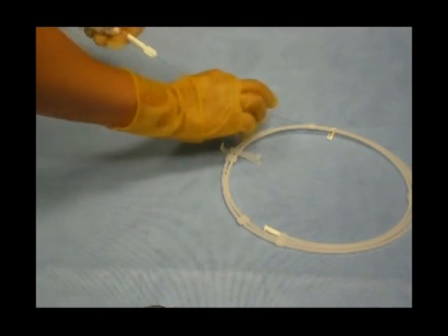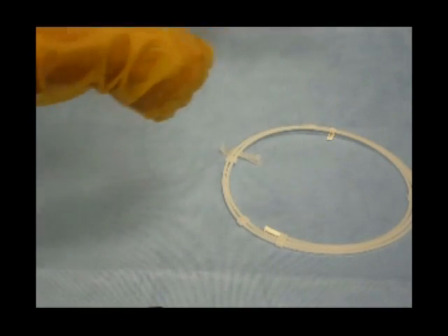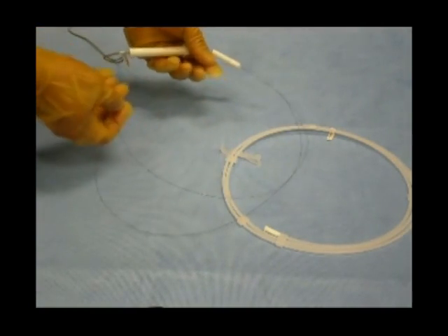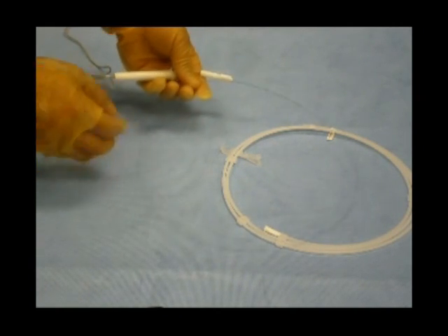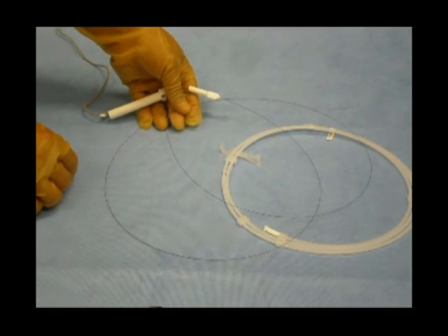Plug the phone jack connector into the PIM FFR and the wire will auto zero. Do not touch the wire at this time. Once the wire is zeroed, remove it from the hoop and shape the tip as needed. Note that the transducer is 3 centimeters from the tip.